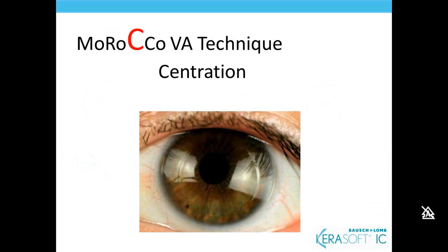Centration is obvious. This lens has an 8 millimeter optic zone. One thing I will caution you with this lens is it's really important to take the housing of the slit lamp and put it directly in front of the patient, because when you change the angle of the light, you're going to see that the angle of the centration seems to be displaced. So again, the best way to observe this is with your housing directly in front of the patient's eye, and you'll be able to really see that central optic zone. It is an 8 millimeter optic zone, and it's highlighted really nicely with the slit lamp.